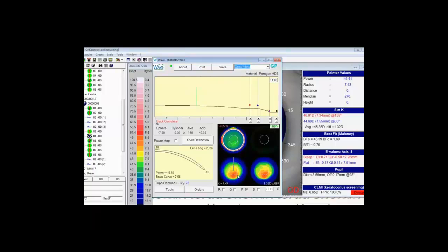And the back curvature immediately matches what the cornea looks like because we've made it aspheric. If you make an aspheric lens, the placement of the optic zone really doesn't matter as much because the whole lens is aspheric anyway. Normally the placement of your optic zone is going to dictate where you change from your non-aspheric optic zone to your aspheric peripheral curves.